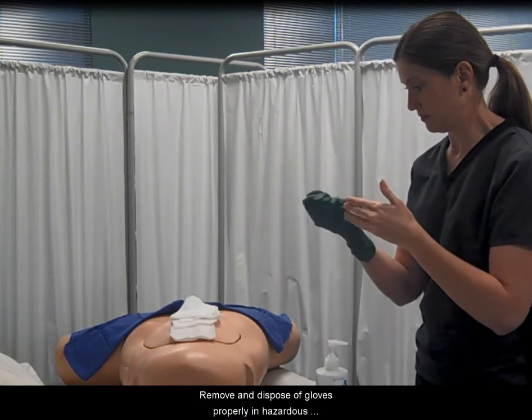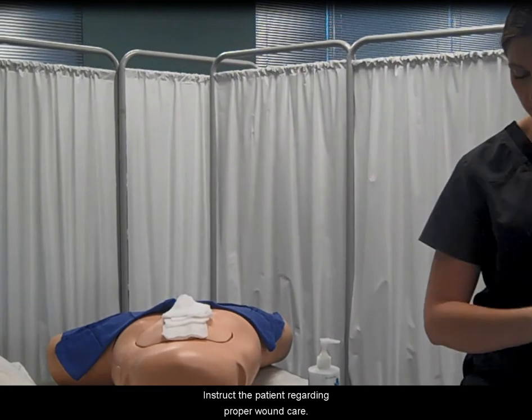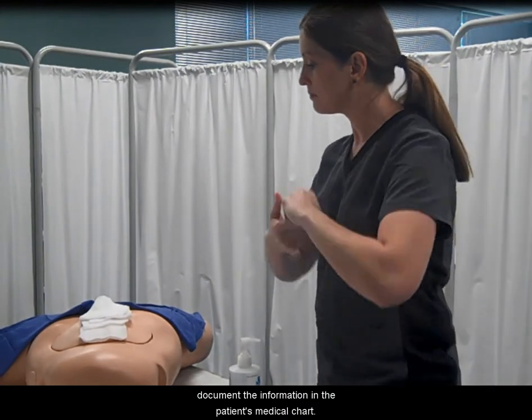Remove and dispose of gloves properly in a hazardous waste container. Instruct the patient regarding proper wound care, provide both verbal and written instructions, and document the information in the patient's medical chart.